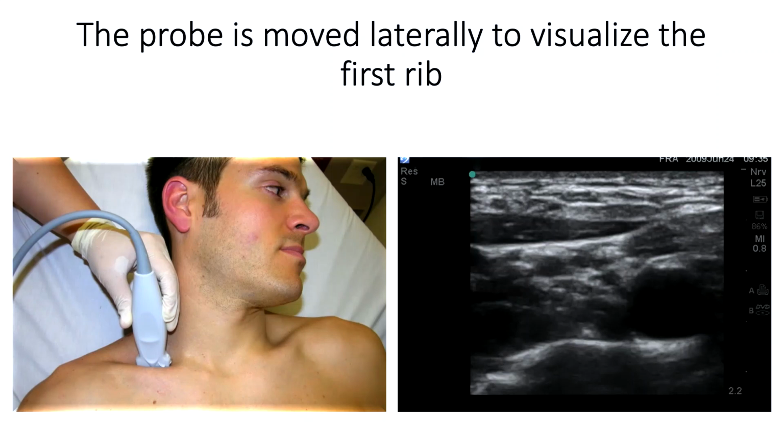Sometimes I come to load my local anesthetic there and I see a team chasing a nerve that is in the upper corner of the screen, and then there is another one that is over here. Don't chase the nerves. Just look for the compartment, inject your local, and just realize that the local will find all the nerves that are necessary to find. As much as when we do an epidural, we recognize that we are in the epidural space, and then we inject a volume of local anesthetic that actually reaches your targets, and it will be volume dependent.